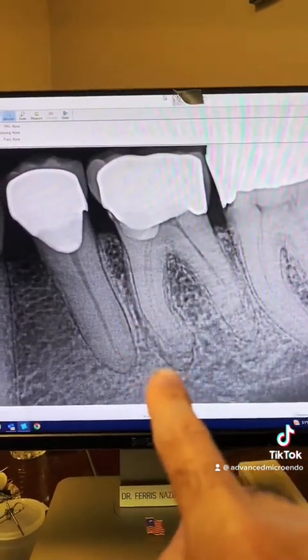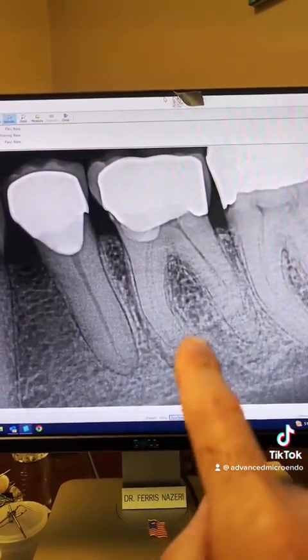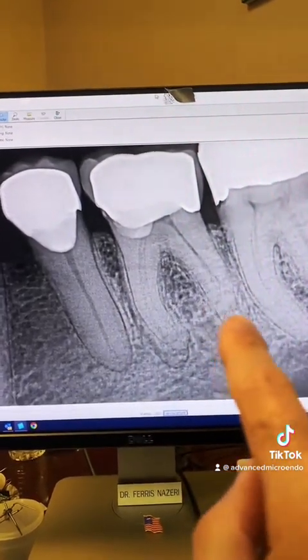And calcified canals. Look at that. One root there, one root there, one root there. Look at all of that.